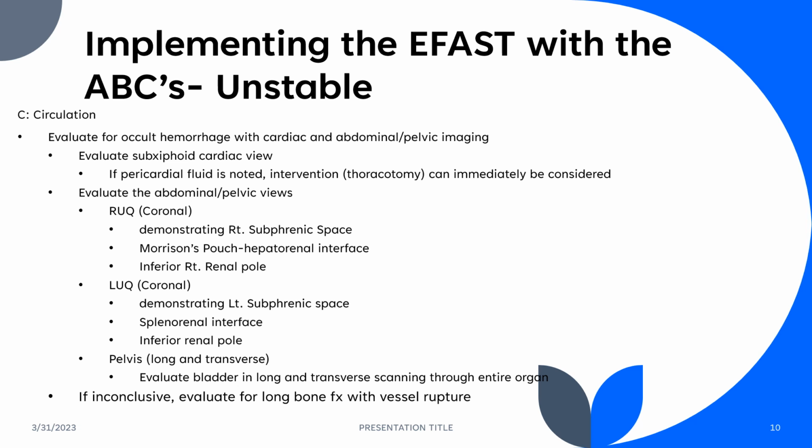Now you notice we're not evaluating the actual abdominal aorta, and part of the reason is that if there is some sort of bleed from the abdominal aorta, it's going to be demonstrated with fluid collection in some of these potential spaces. So this is just the briefest, most direct way to find that fluid so that it can be addressed as quickly as possible.